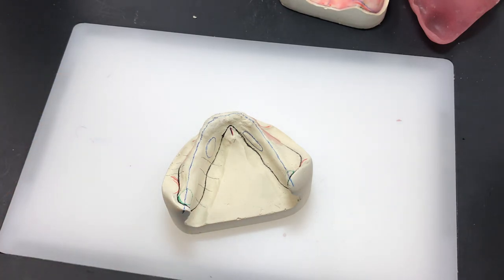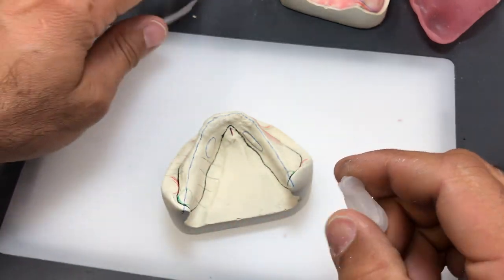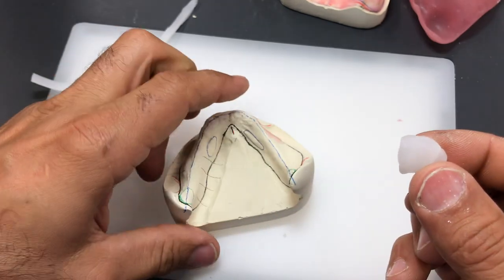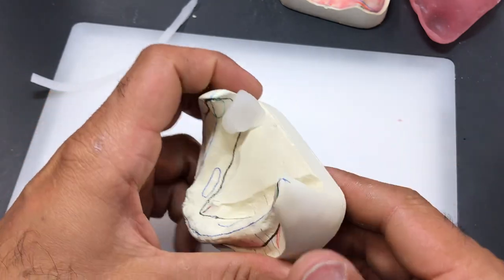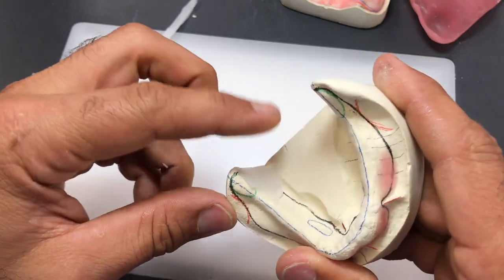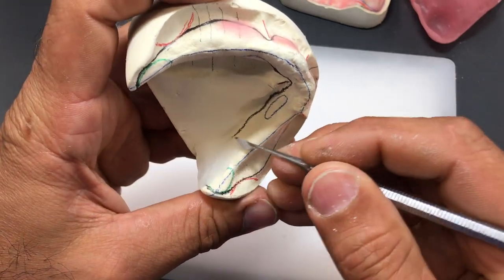is take a little bit of utility wax, roll it up, squish it together. So now I got a little wax ball, and I'm going to pinch it into position. And that took very little time, and it's very clean.